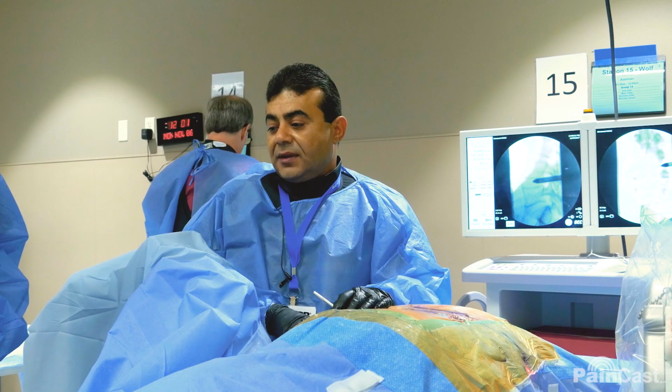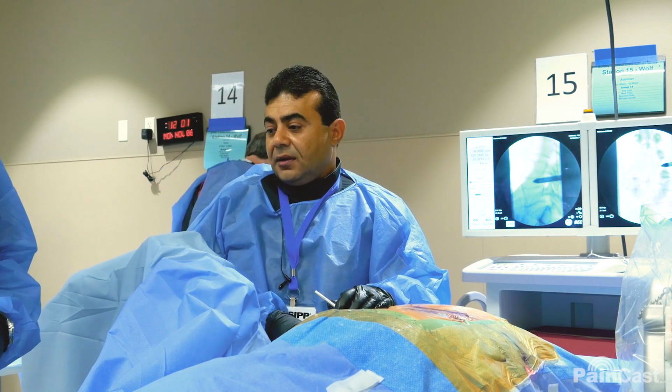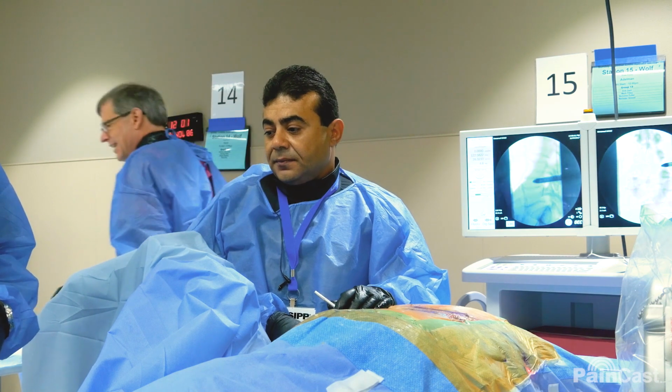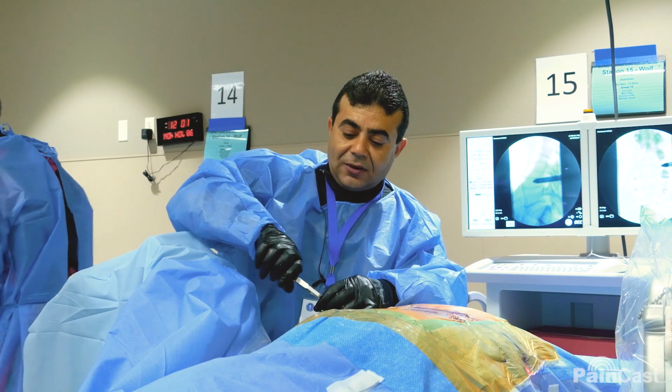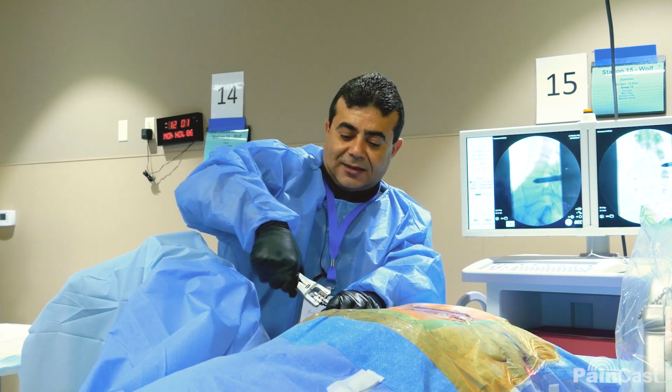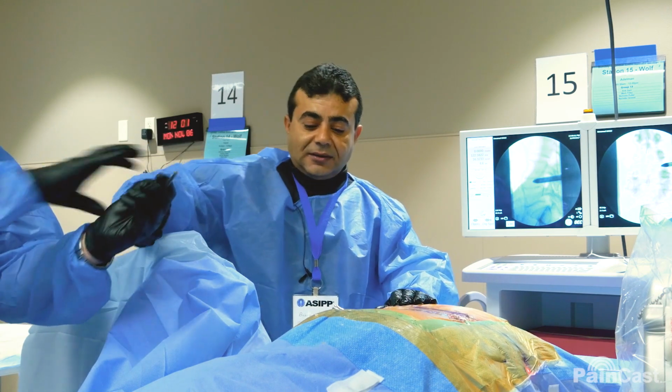You want to use this one because the other ones can damage the dilator. If it doesn't hook, like it's not doing with me, you can put a 4x4 and get it there. But here it is, it's out.